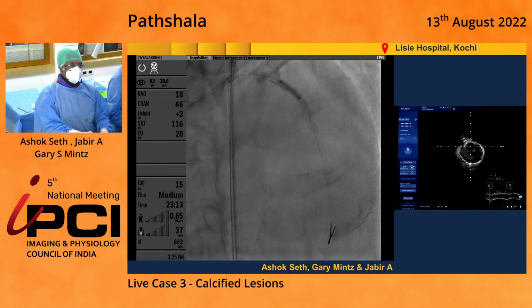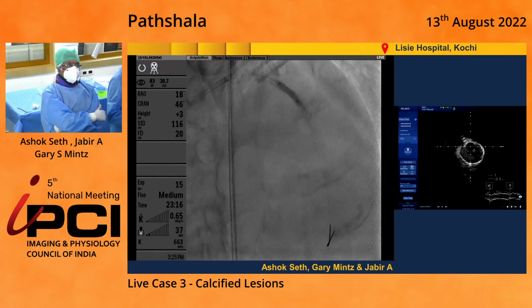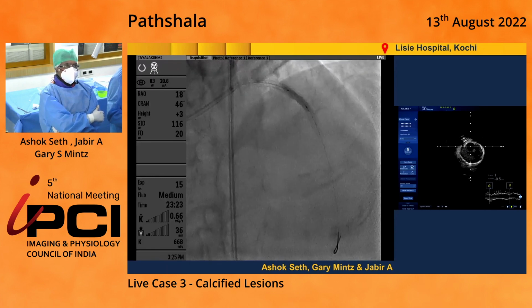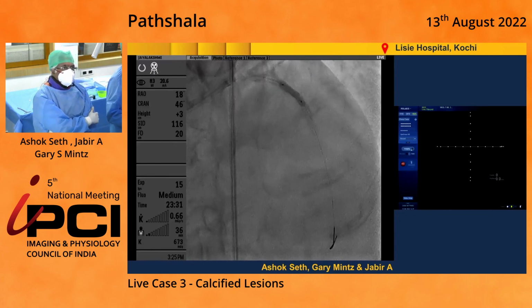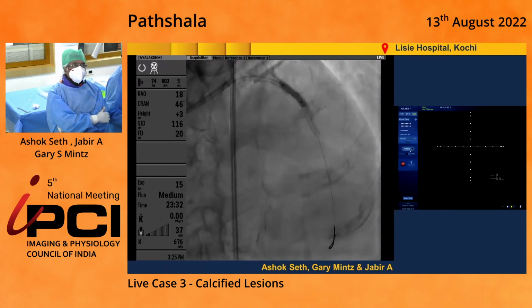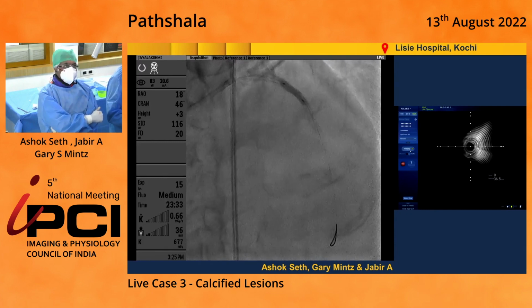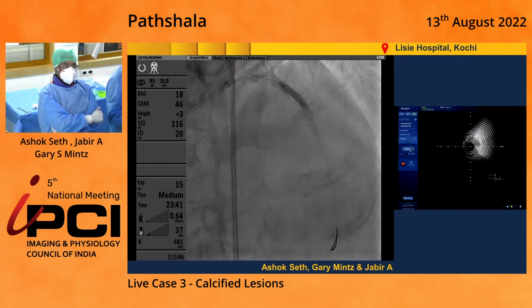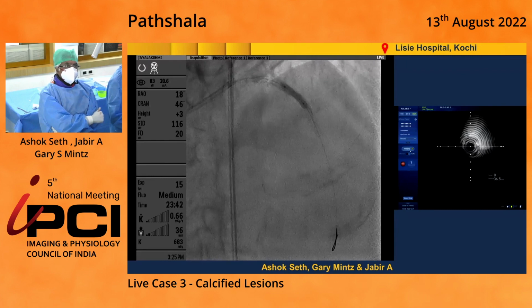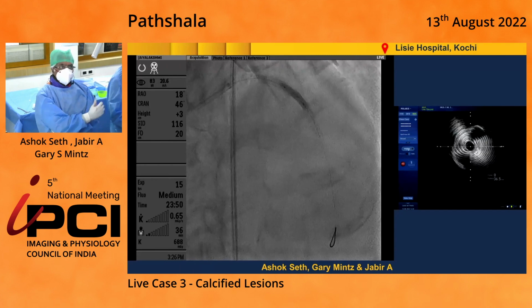Okay. I'm at 10, 15, 20. Yeah, okay. 25. Now just stay at 25, and then we'll start going up. 27. So just a comment for the audience. Ashok, we talked about this before. Correct. IVL will crack the plate, but your NC or OPN balloon is going to break the plate. 29. So we are at 29. 32. 34. 35. And I'm going to sit at 35.